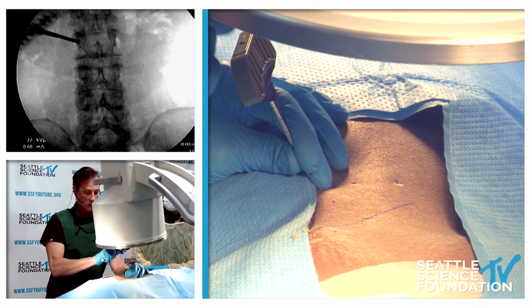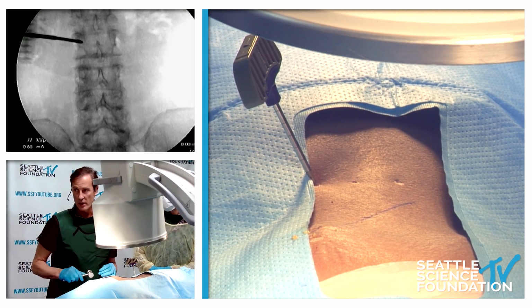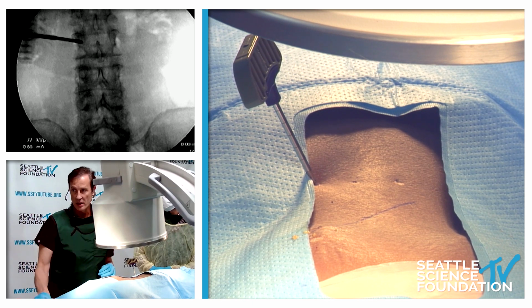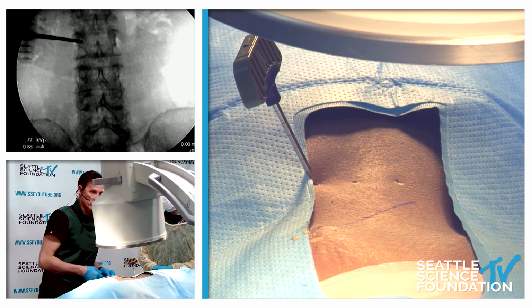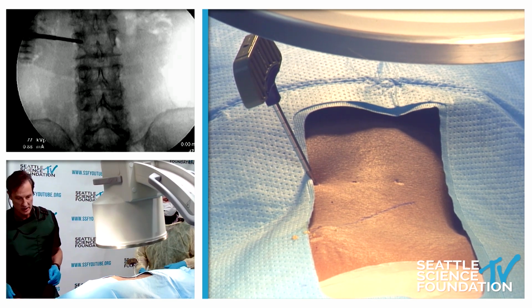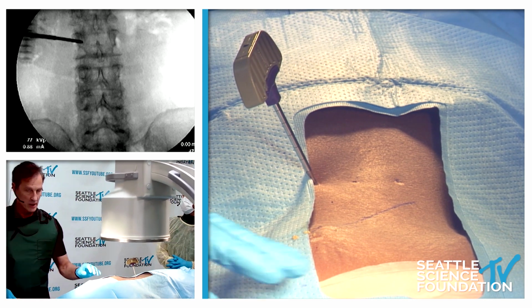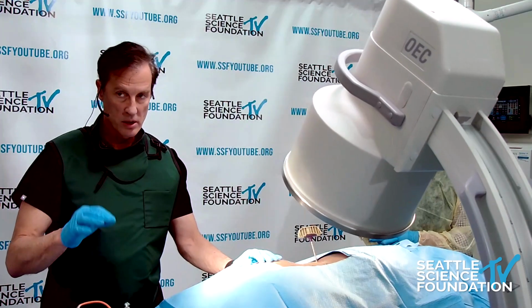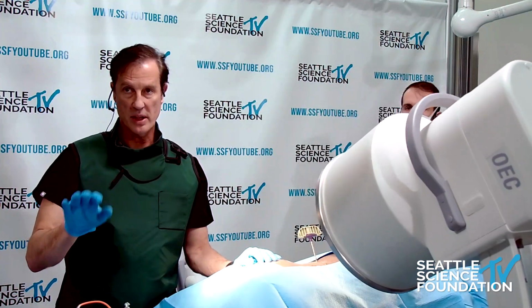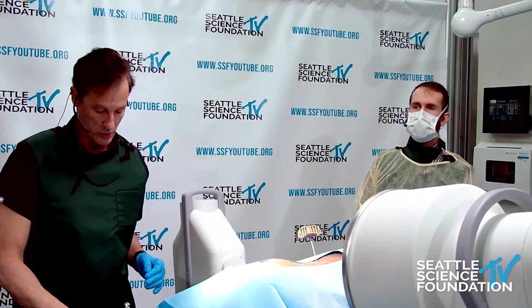And the only real rule about this is before you violate the medial wall of the pedicle, so you see the tip of the needle coming there, you have to make sure you're in the posterior portion of the vertebral body. So at this point, we're going to go lateral, take a view. And if you just follow that simple rule, 10 o'clock and 2 o'clock on left and right respectively, you go down at a 30-degree angle, tap, tap, and if you don't violate the medial wall of the pedicle until you're in the posterior portion of the vertebral body, you'll never make a mistake.